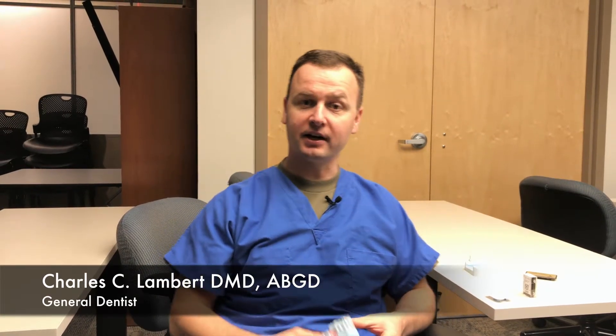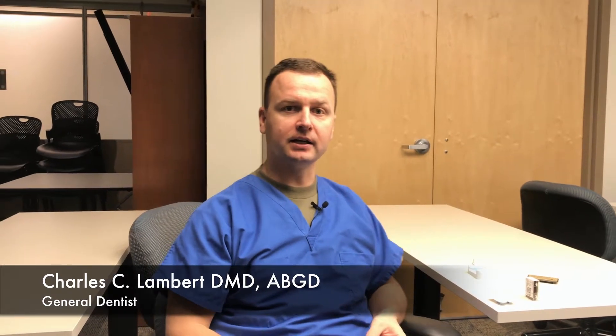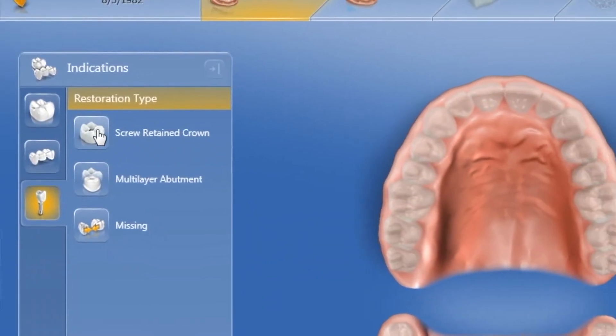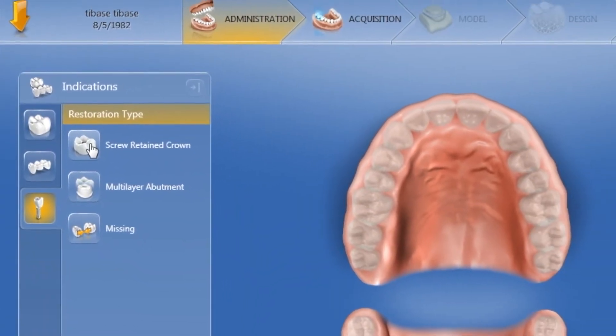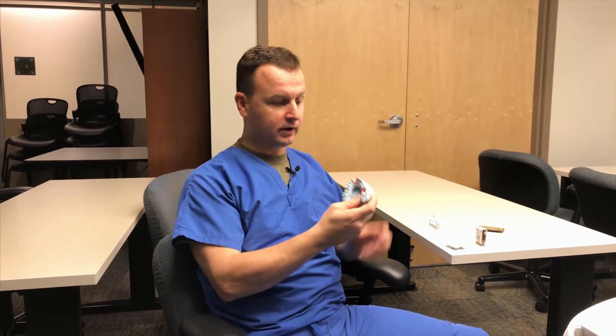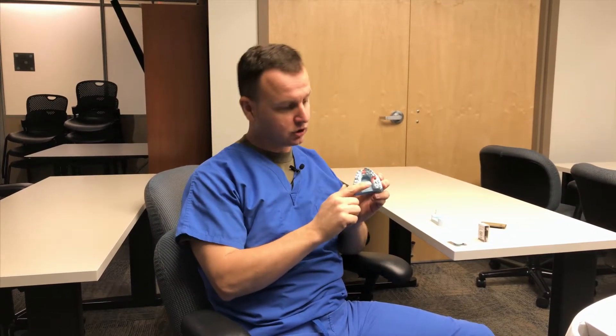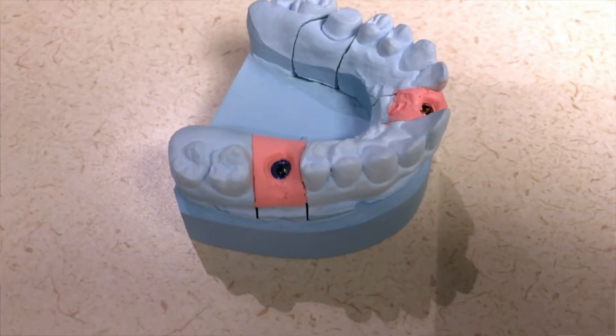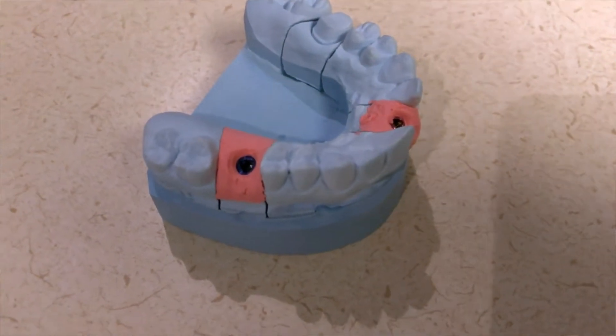Hello. Today we're going to be talking about how to design an implant restoration. We have two options: you can design full contour, which they call screw retained, or you can design it in a split mode where you have a custom abutment and then a cement retained crown on top of that. I have a cast already poured up with tissue moulage in pink, with a Nobel BioCare Replace Select Implant 5.0 which is blue, and we're going to show you how to do a full contoured restoration.